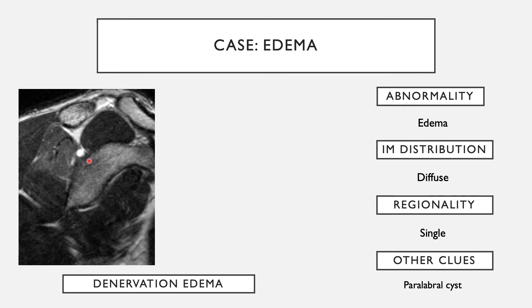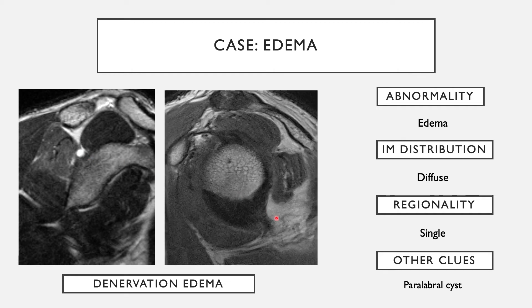As this condition progresses, one might see teres minor atrophy, which is seen fairly commonly in patients with shoulder problems, possibly due to incipient axillary nerve stretch. Remember: denervation edema can be in an acute phase where you see muscle edema, or in a chronic phase where you start to see muscle atrophy.